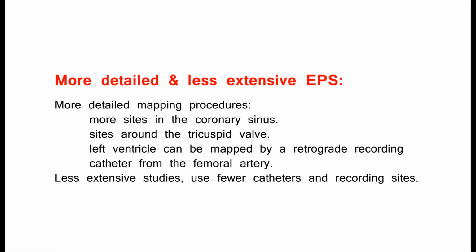More detailed and less extensive EPS. More detailed mapping procedures: more sites in the coronary sinus, sites around the tricuspid valve. The left ventricle can be mapped by a retrograde recording catheter from the femoral artery. Less extensive studies use fewer catheters and recording sites.